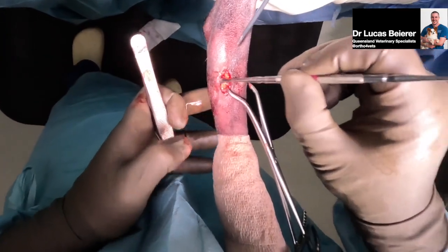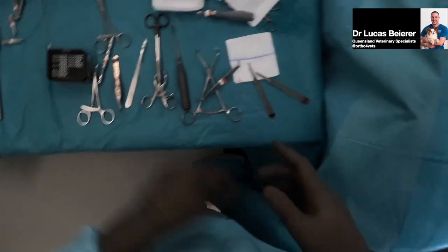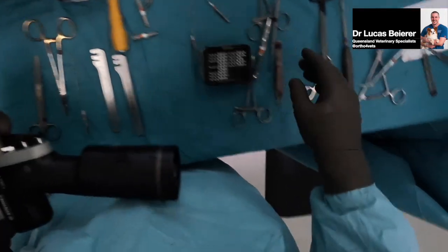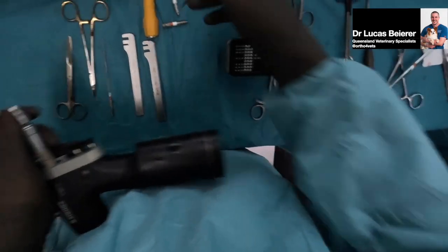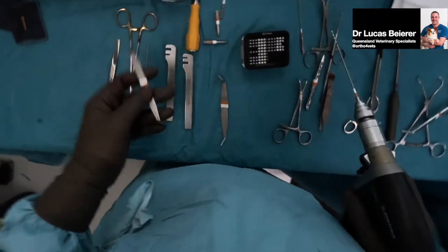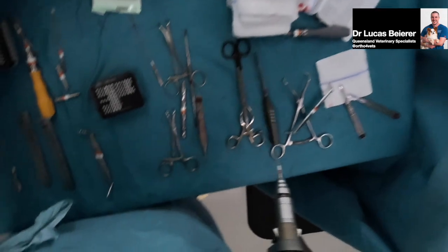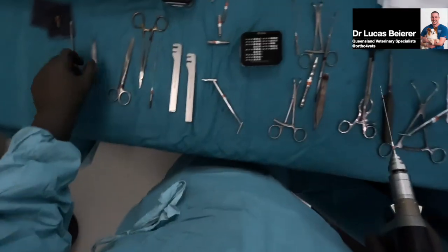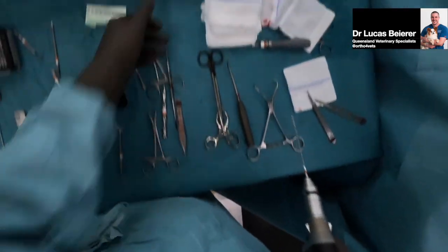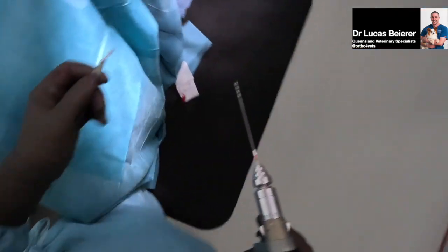So we'll take that where that is. Yeah, it's not going to be perfect, but it's just a starting point for this. So I'll put a 2.4 positional screw across. It should be a double-ended drill guide, hey? Oh, there it was. Okay, let's take the two, it's fine. Yeah, it's fine.